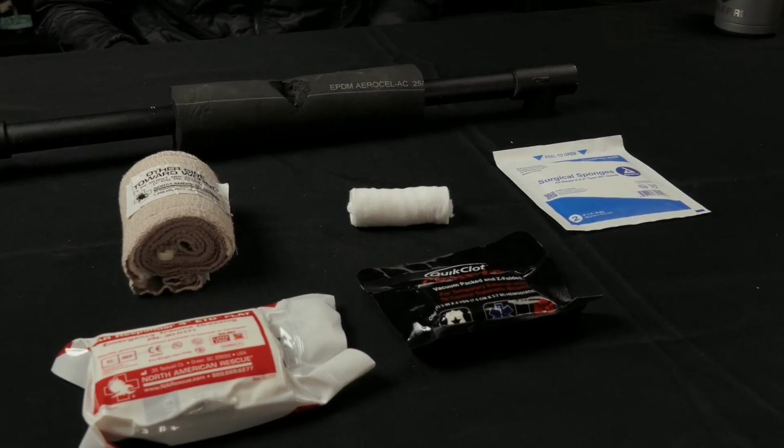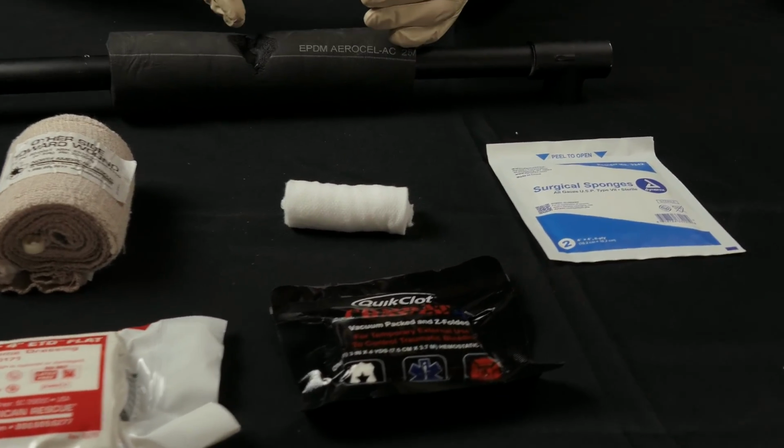Now, another thing that we're doing when we're sweeping that blood out is we're able to see the area and the point of bleeding. So that allows us to apply immediate direct pressure to that area with a finger, and then we can start packing on top of that, but we know exactly where we need to apply that pressure rather than just blindly packing it in the wound. So let's run through this. So I've got my stuff laid out here. I've got a wound. I'm gonna try to apply immediate direct pressure to stop that bleeding as fast as I can.